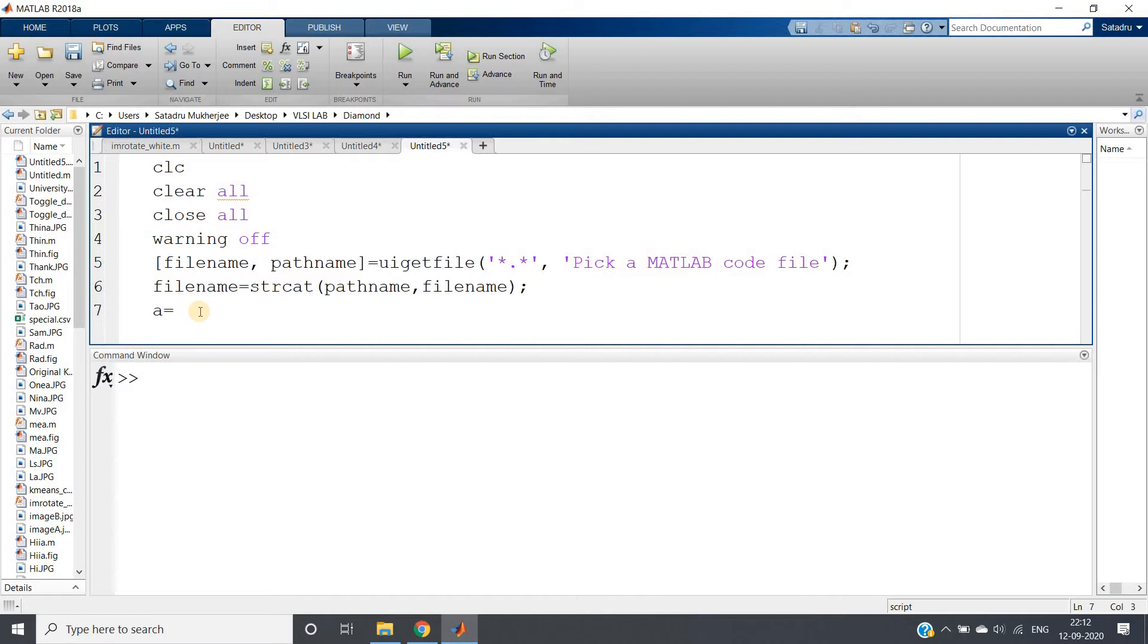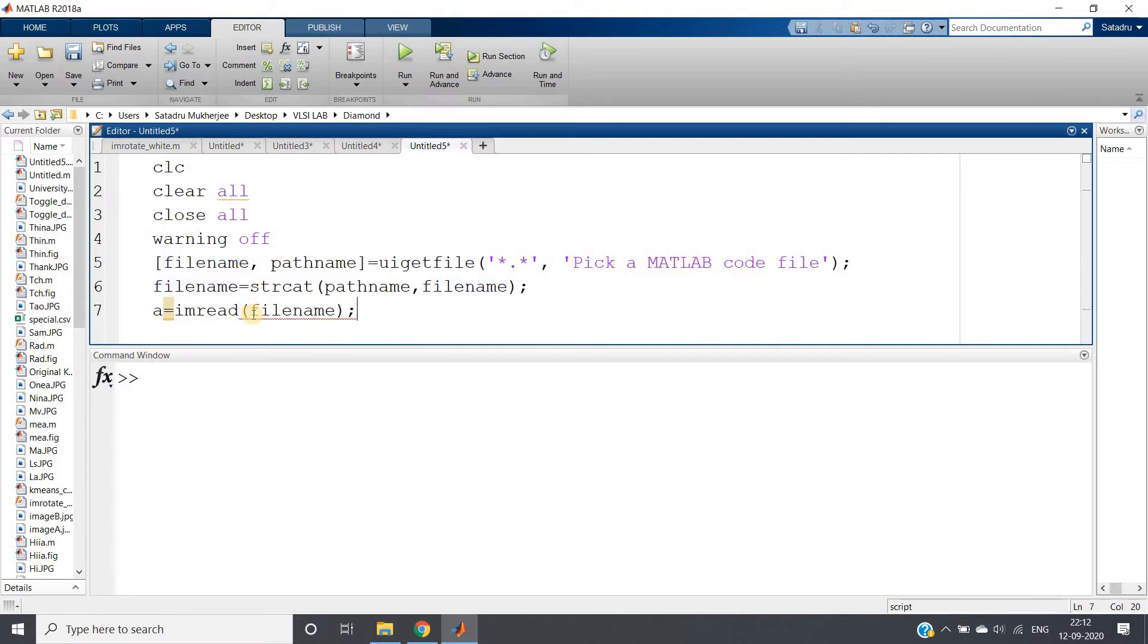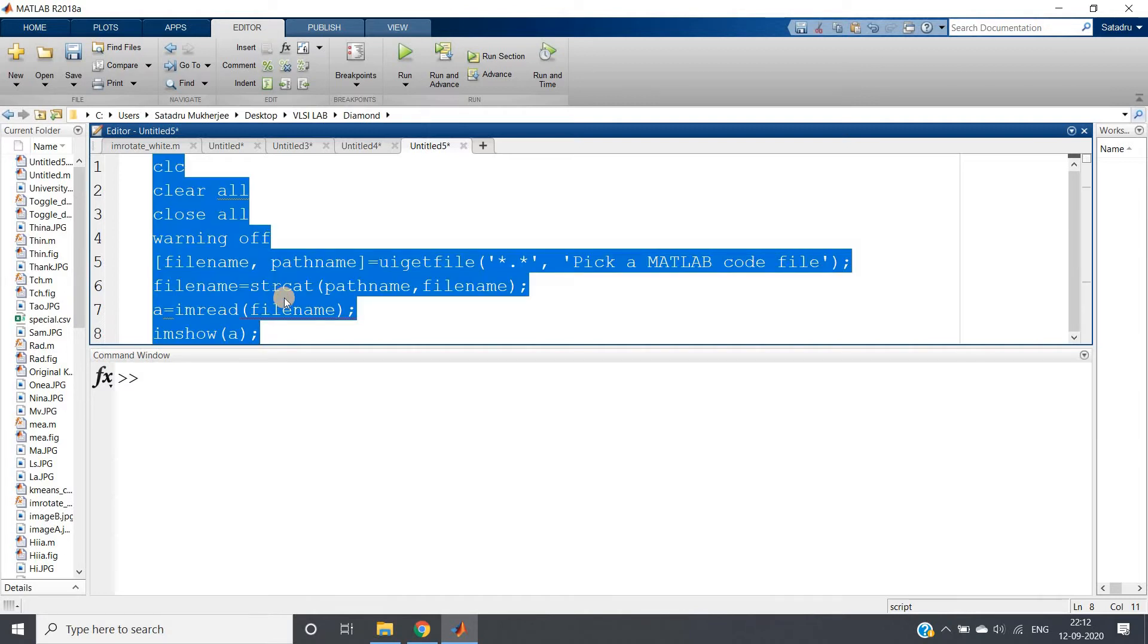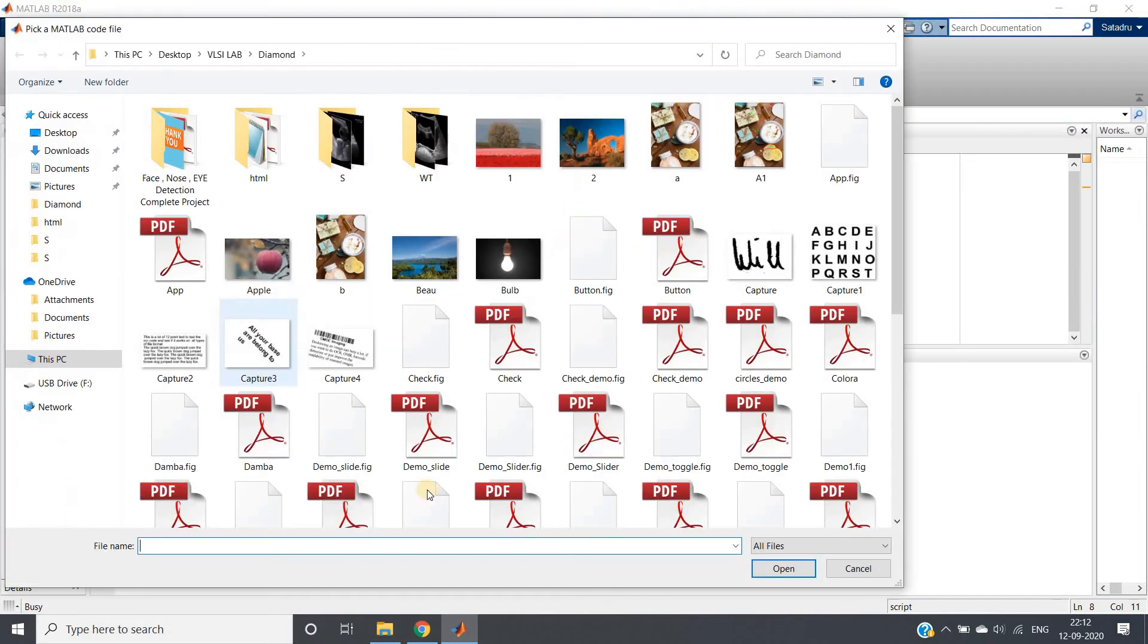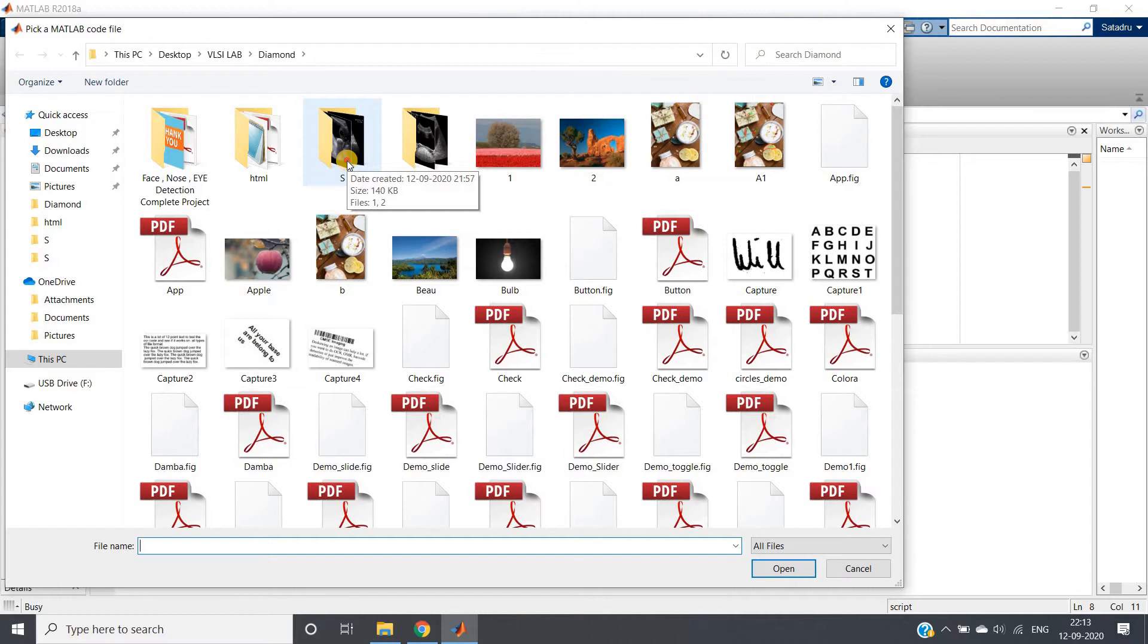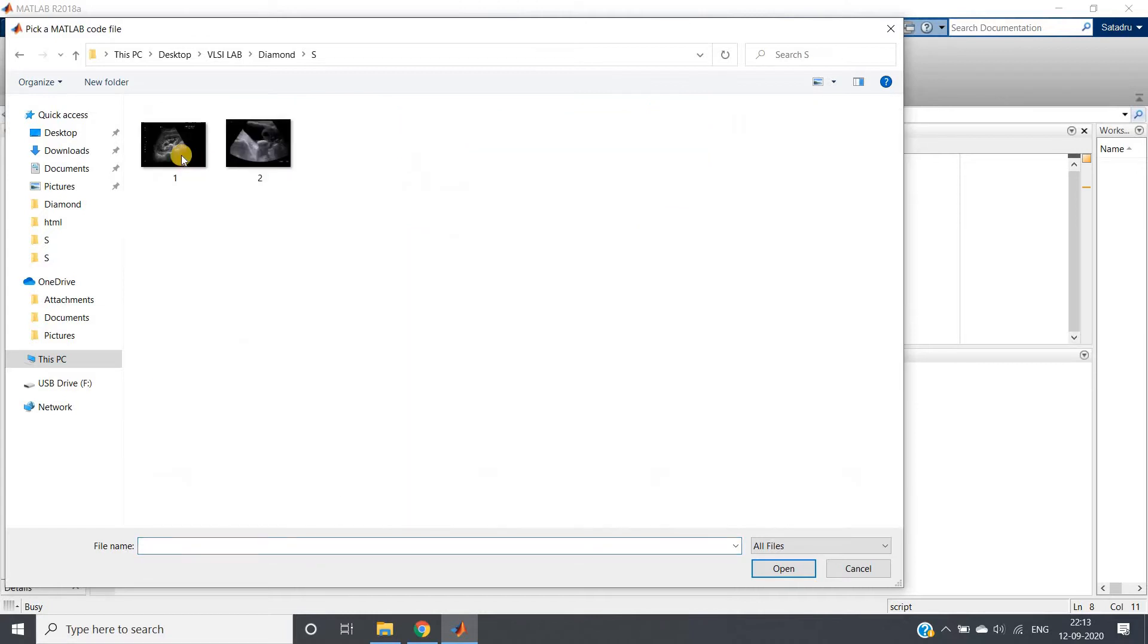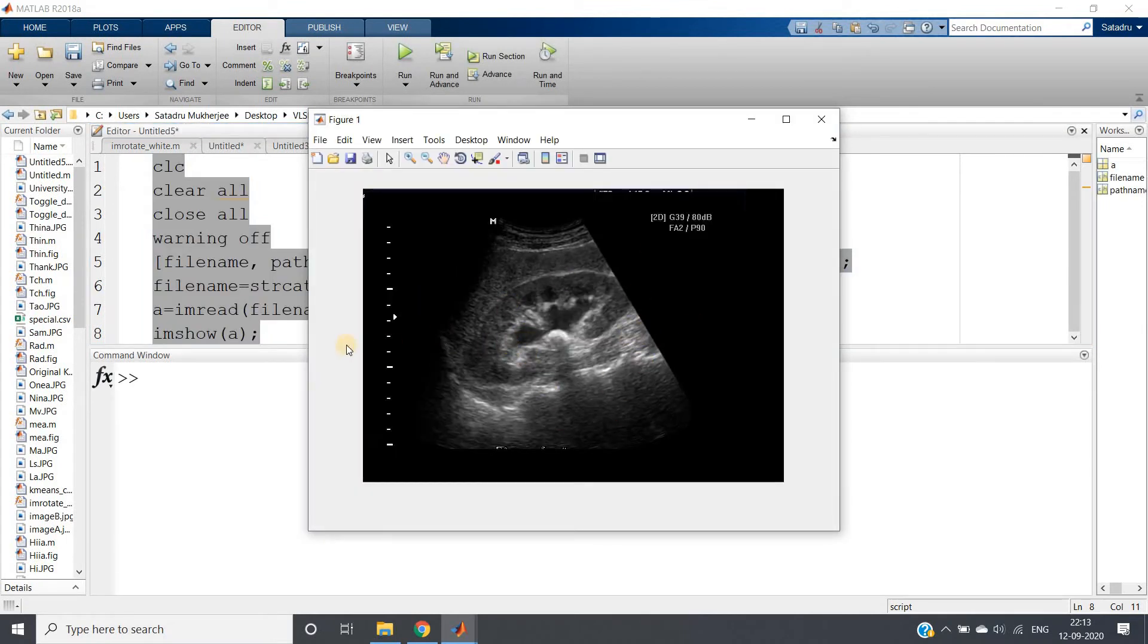Right so now we are ready to take input image. I am writing a equal to imread this filename. And imshow a. Let me show you how it is working actually. See as soon as I run the code it is opening this kind of window and we are allowed to browse and take image anywhere present in our local system. It will not be the MATLAB current directory only. So here I am going to this particular folder and taking one image which is present in that folder.